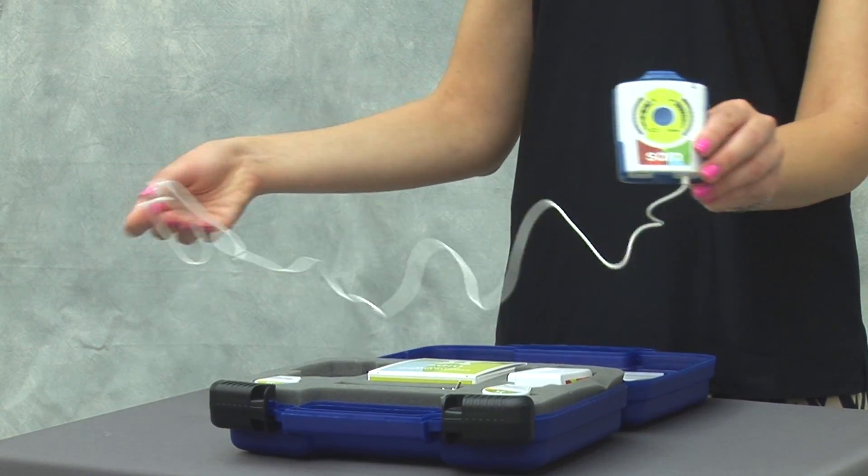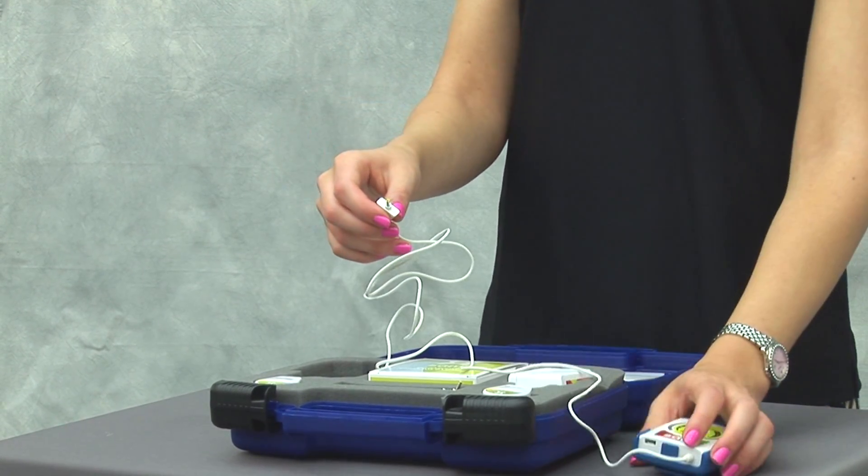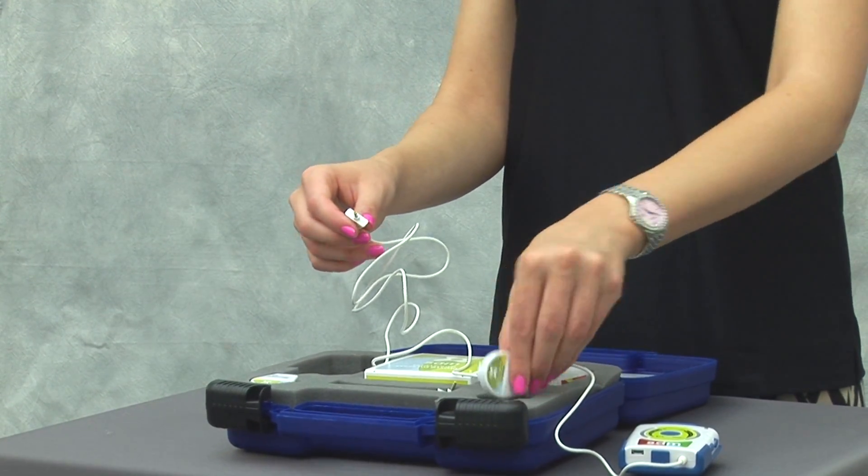A SAM power controller with a belt clip, and applicators that deliver ultrasound energy.